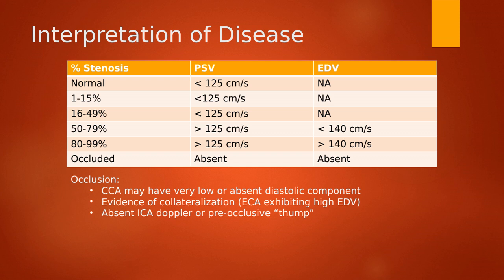That's going to be the blood flow hitting up against that complete blockage, and it's producing this thump, thump, thump. It's like a knocking on the door. The blood flow is knocking on the door. It's saying, hi, let me in. And the door's like, no, I'm not opening. So it's knocking on that blocked occlusion.